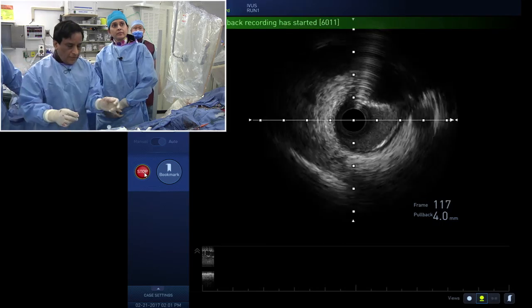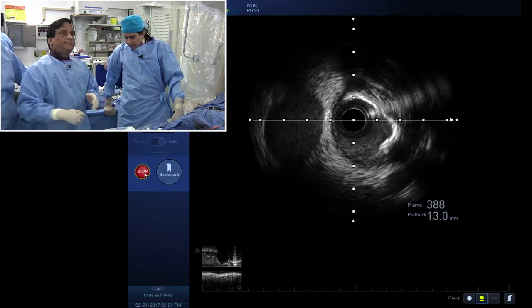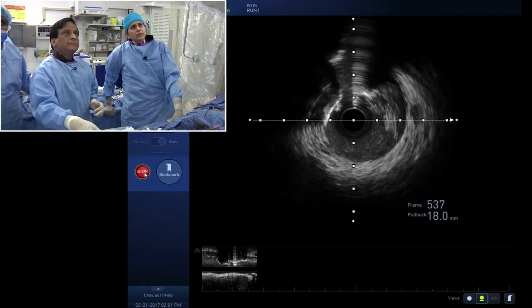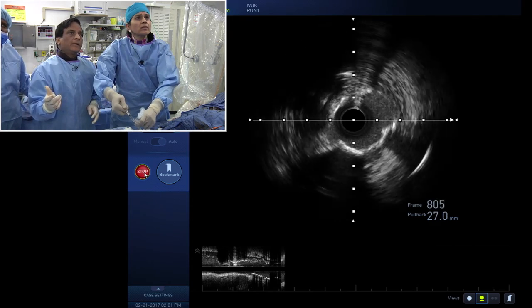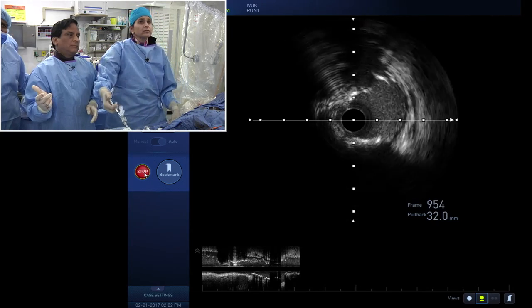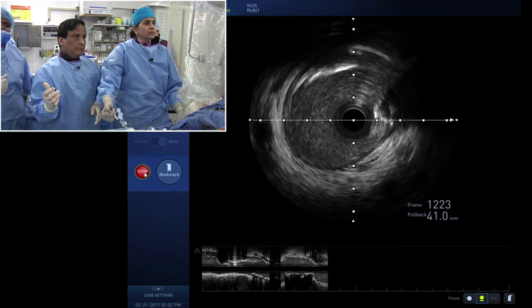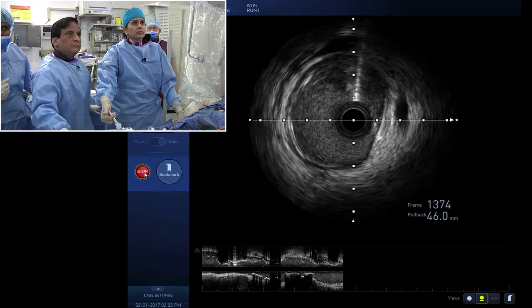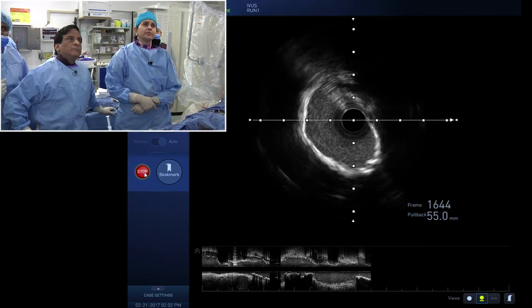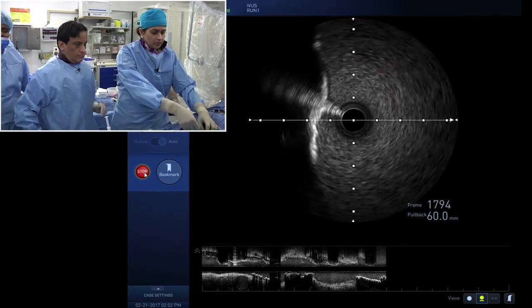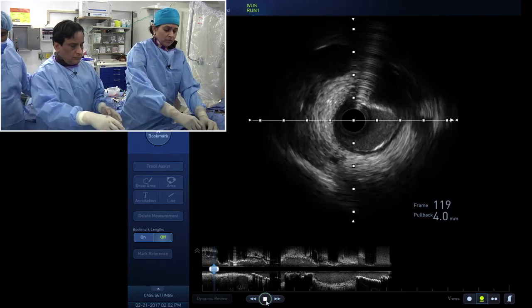You can see — right at 11 o'clock, or I mean one o'clock — we got a glimpse of it. Similar to the case shown yesterday at Washington Hospital Center, you don't see this with orbital atherectomy. Now this is almost circular calcium. At one point you saw the kind of invagination of the calcium. This is the more proximal ostial LAD, now coming to the circumflex and now the left main. We can stop and pause — I bet we can see a frame that demonstrates what I'm talking about, which is the eccentric bite out of the circumferential calcium.